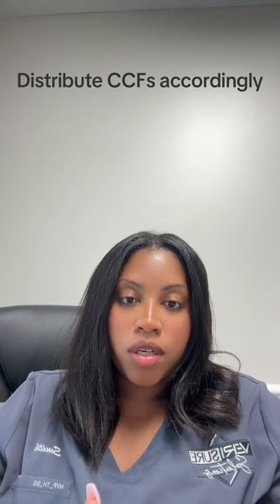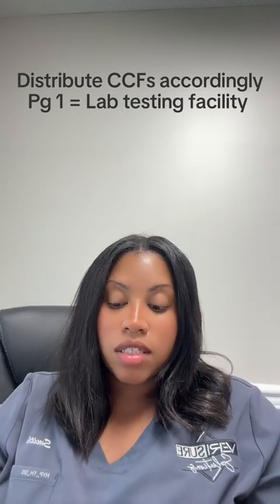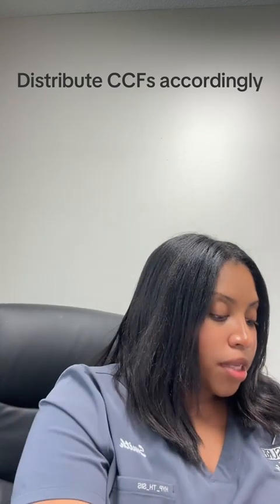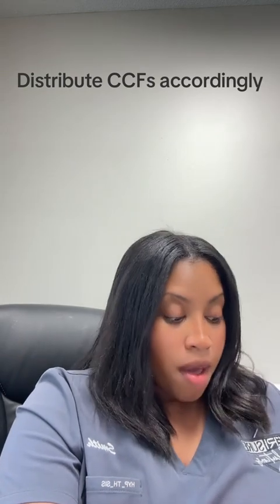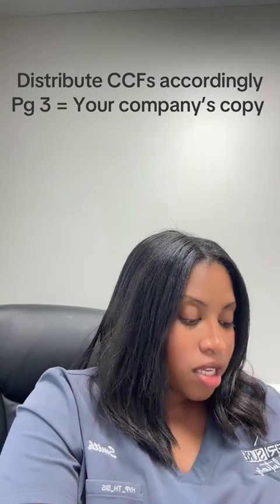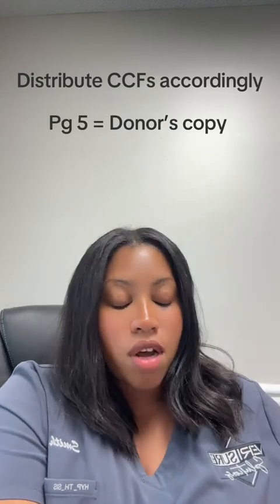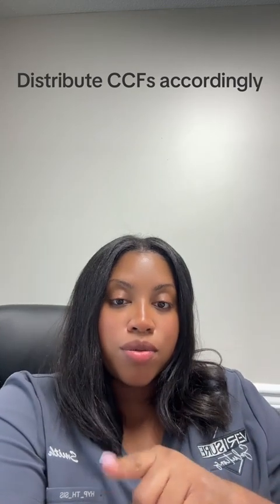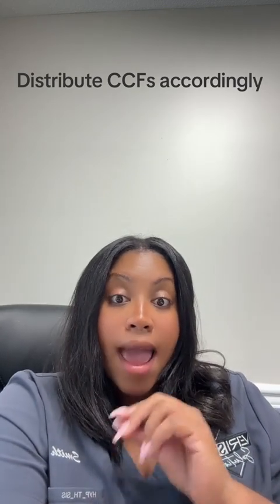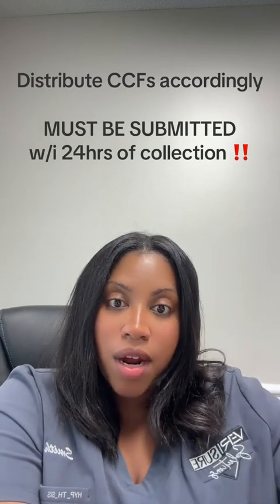You're then going to take the CCF copies and distribute them accordingly. So page 1 is already inside the specimen bag, going to the testing facility. Copy number 2, page 2, is going to go to the medical review officer, the MRO. Page 3 is for the collector to keep, which you should keep for a minimum of 30 days. Page 4 goes to the employer, and page 5 goes to the donor. So the MRO copy, which is 2, and the employer copy, which is 4, have to be submitted within 24 hours of the collection process.